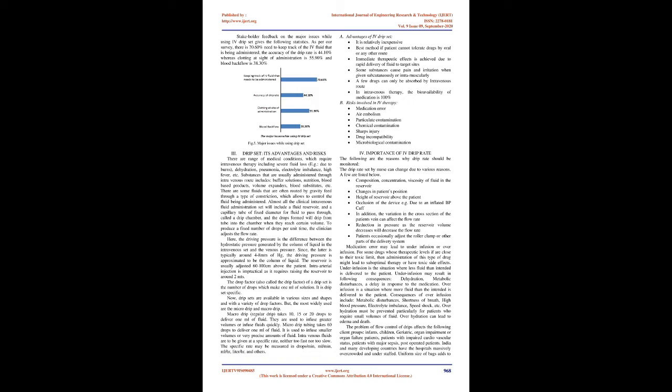Here, the driving pressure is the difference between the hydrostatic pressure generated by the column of liquid in the intravenous set and the venous pressure. Since the latter is typically around 4 to 8 mm of Hg, the driving pressure is approximated to be the column of liquid.